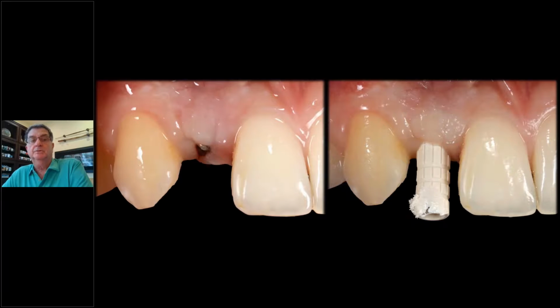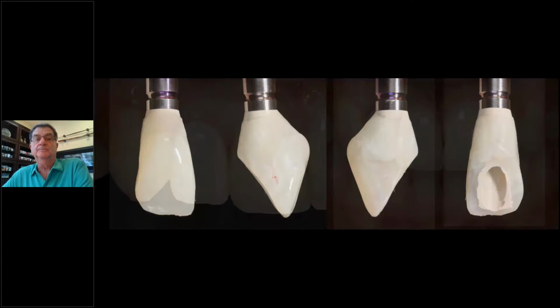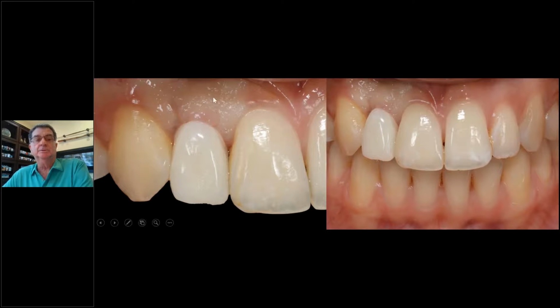So here it is after healing. Now Steve's going to start sculpting the tissue because this is a healed ridge. That's the sacrifice of not putting on a temporary at the time of surgery. So on a healed ridge, papilla sparing incision, straight healing abutment, then come back after you've uncovered it, if you didn't do it together, and then stretch the tissue. After 4 weeks, you start stretching the tissue with your temporary. There's the blanching, so it's still healing. There's the blanching, we stain it.